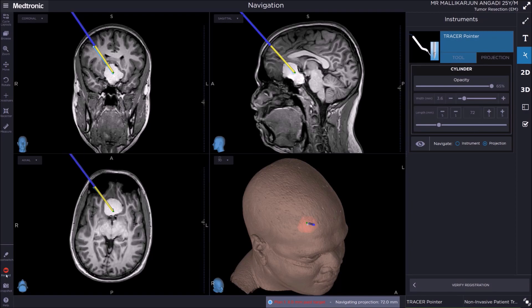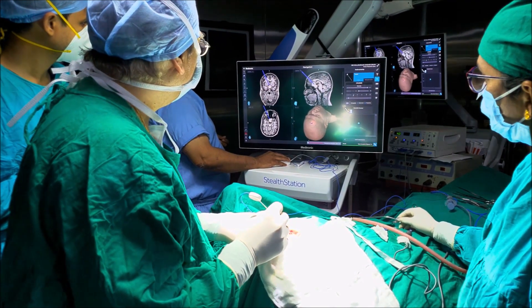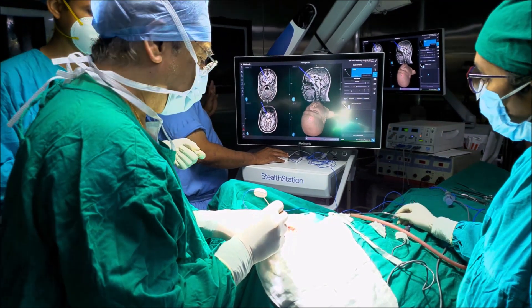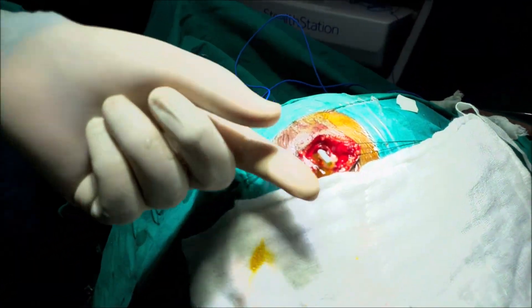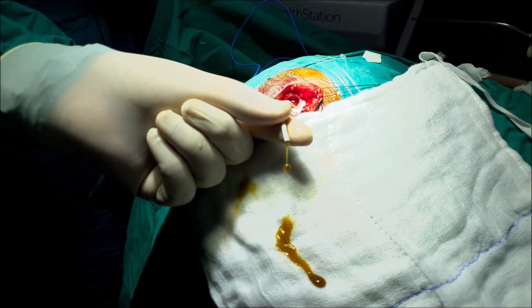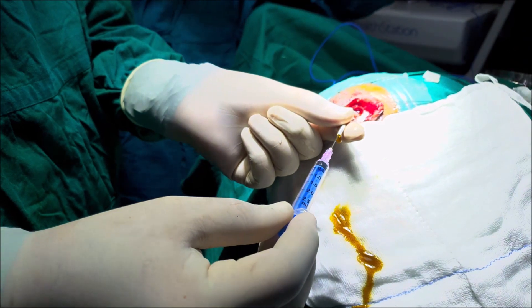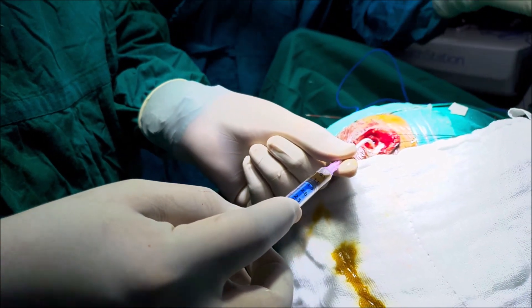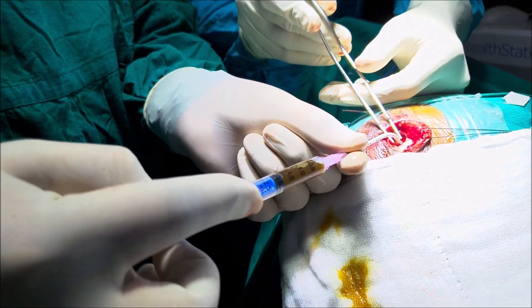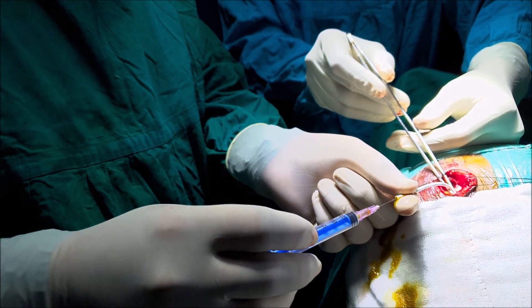Every step of the procedure, millimeter by millimeter, is navigated so that the brain is not injured at all. You can see the progression of the blue line — that is the catheter tip going inside the cyst. The wall of the cyst will be calcified and firm; one needs to use a little force to break through the cyst wall and enter. There is a thick greenish-yellowish craniopharyngioma fluid coming out under pressure. Gently, with a 2 cc syringe, the cyst fluid is aspirated — the suction force used should be very slow and gentle.